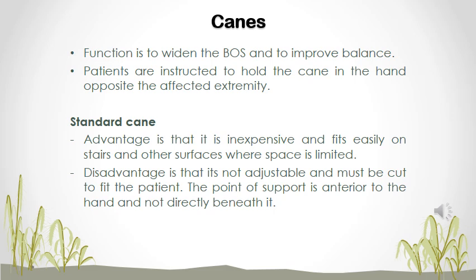Patients are instructed to hold the cane in the hand opposite to the affected side. So if your right leg, knee is very painful, you're going to hold the cane in the left hand. A standard cane, the advantage is that it's not expensive. It fits easily. You can walk on stairs with it and other surfaces where the space is cramped.